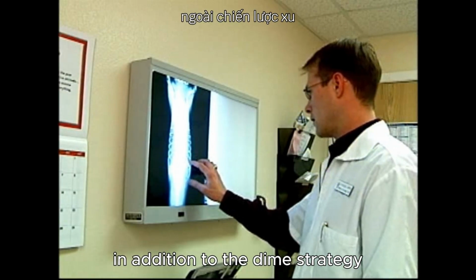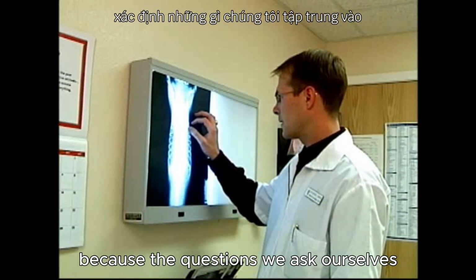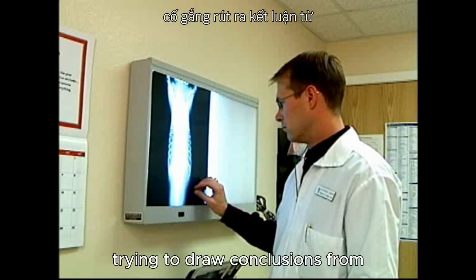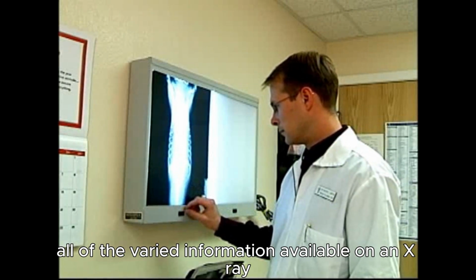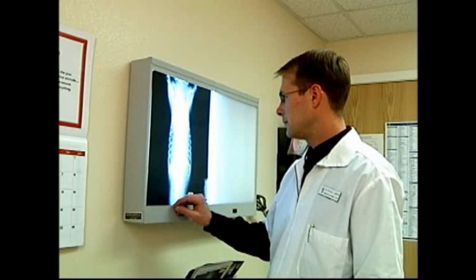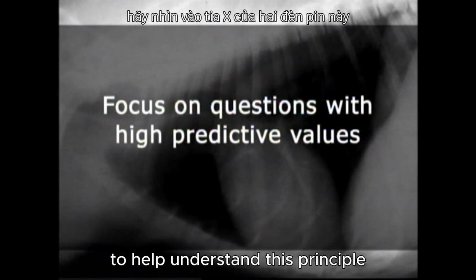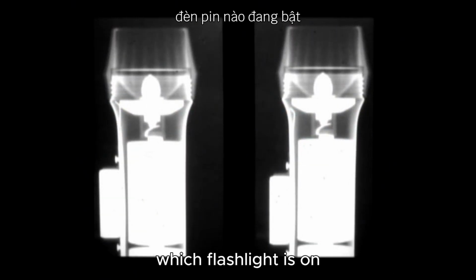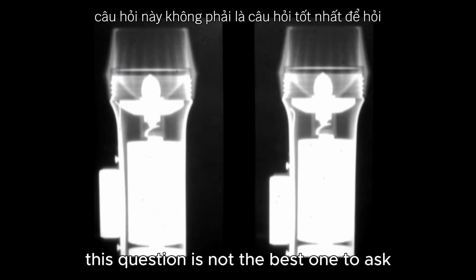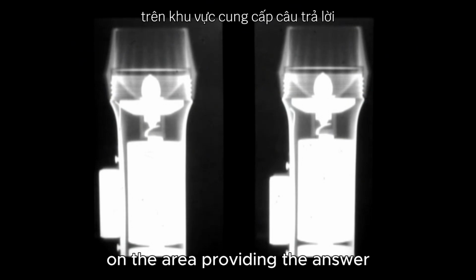In addition to the dime strategy, it is important to ask the right questions because the questions we ask ourselves determine what we focus on. Trying to draw conclusions from all of the varied information available on an X-ray can be difficult and lead to errors. You need to learn to focus on questions that truly have high predictive values. To help understand this principle, let's look at this X-ray of two flashlights. Which flashlight is on? This question is not the best one to ask because it does not directly focus your attention on the area providing the answer.